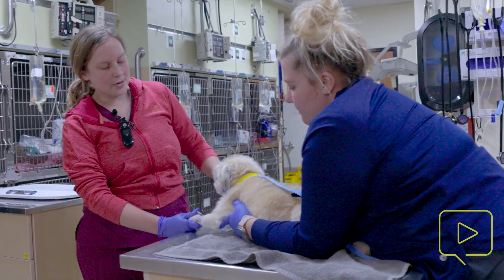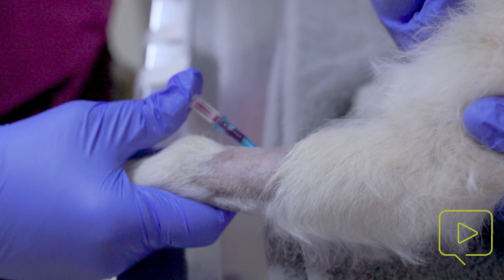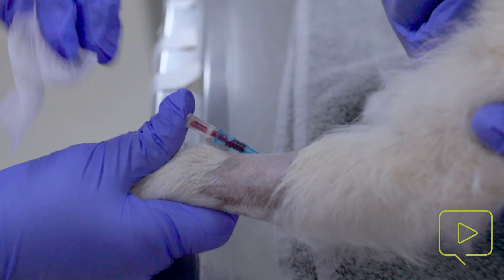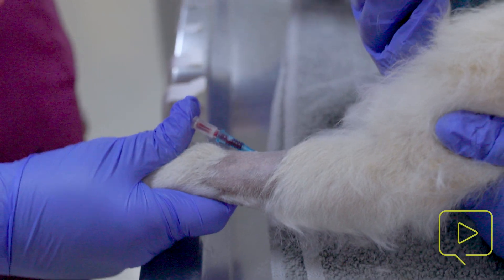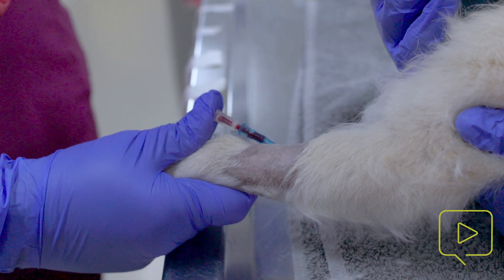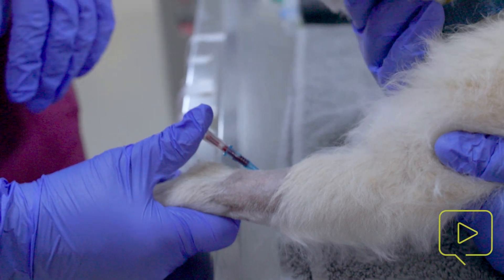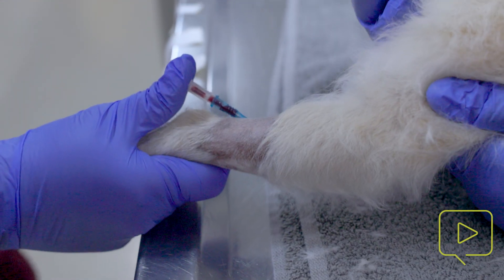As you can see, we have an IV catheter placed for this patient. The first thing we want to do for taping is make sure that it's clean and dry in this area. If there's any blood around, I would take some gauze — some patients have really good blood pressure and have wiggled — so I would get maybe a little bit of peroxide on some gauze, clean it up, and then follow it up with a dry piece of gauze to dry it off. His is actually pretty clean; he's been a very good patient for this.